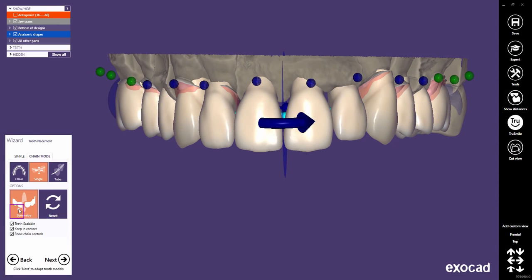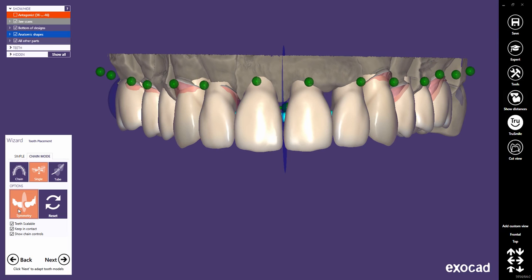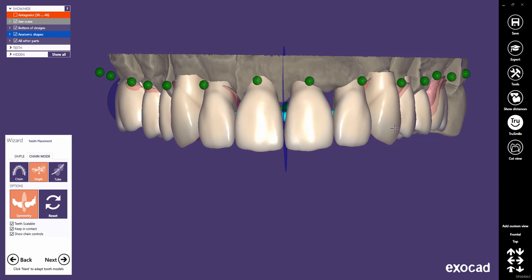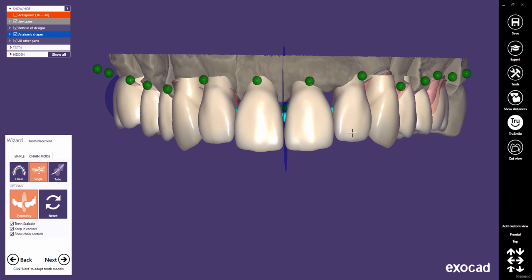Control points appear blue for teeth which will be considered in the symmetry mode. When moving teeth in front symmetry, the position of the posteriors can be influenced too if they are not locked in position. In single mode, each tooth transformation will be mirrored along the symmetry plane.